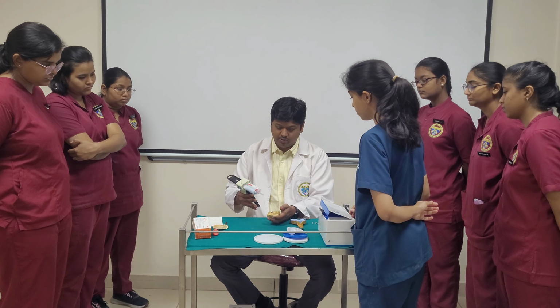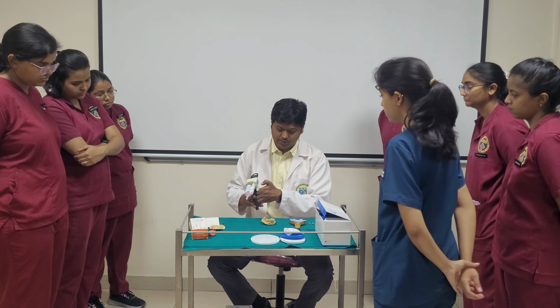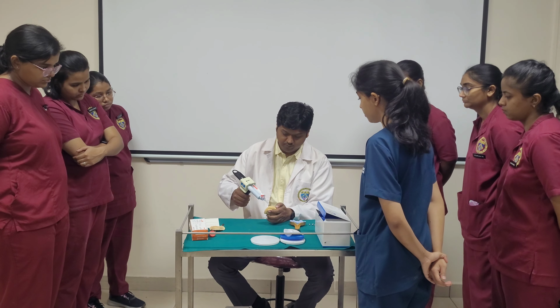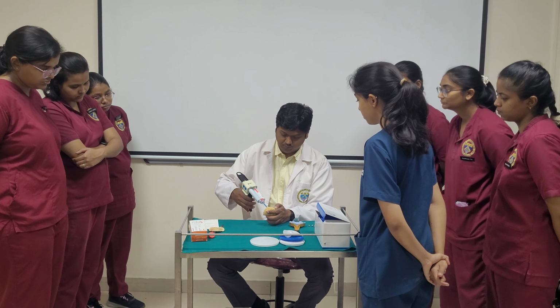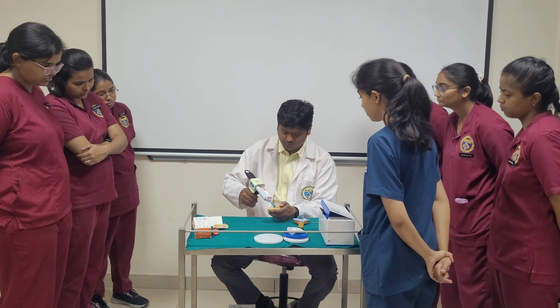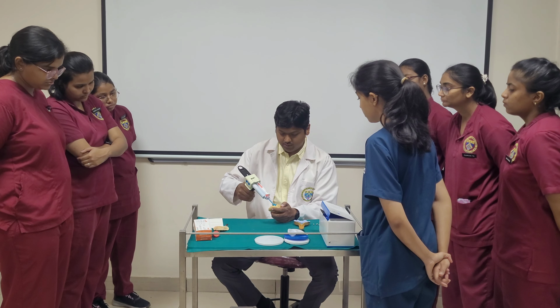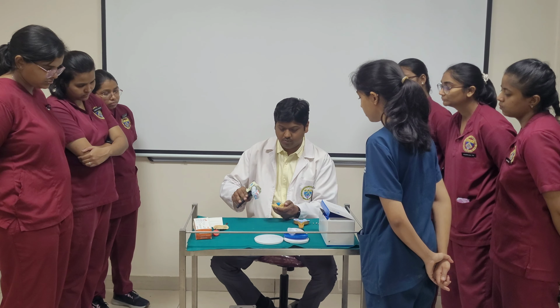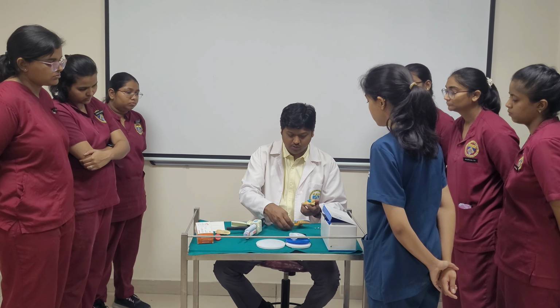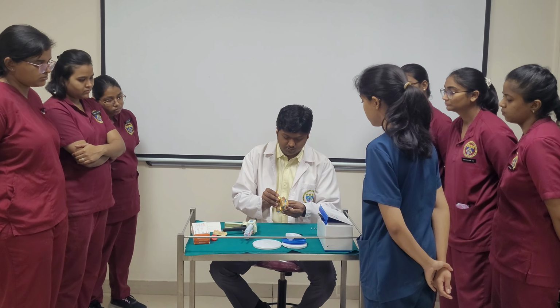then injected inside the patient's mouth or all around the transfer coping. Bit on the adjacent teeth also, and load the putty over the teeth.